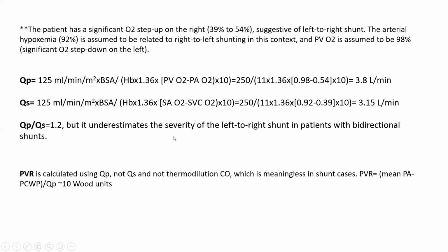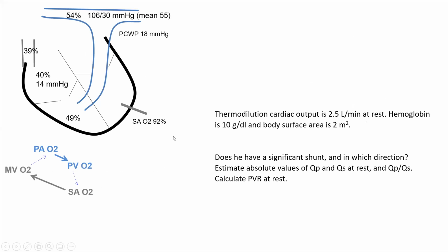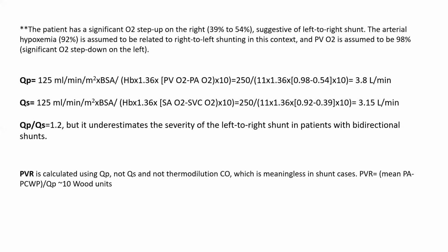The more important thing for me at this stage with this pulmonary hypertension, 106/30, is to determine. So he has PA 106/30, and he has right to left shunt. So I want to determine, is the shunt already at an irreversible stage, irreversible PA pressure? At a stage where I cannot close that VSD. So this is why PVR is important. So I used PVR calculation.